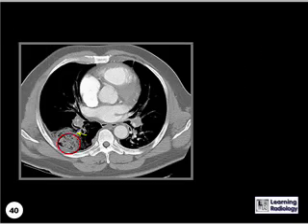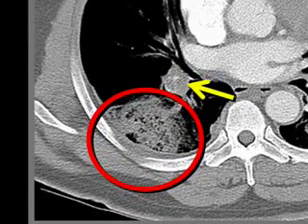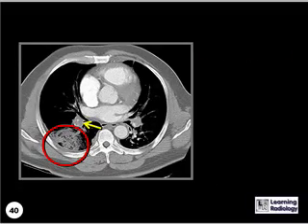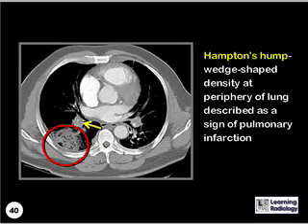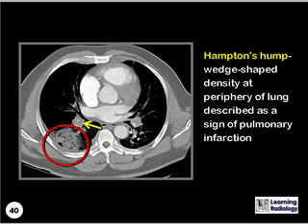What is the name of that density associated with what the yellow arrow is pointing to? That's a Hampton's hump, a wedge-shaped density at the periphery of the lung, described as a sign of pulmonary infarction. The yellow arrow is pointing to a thrombus.